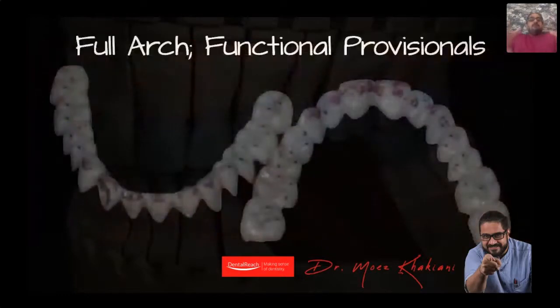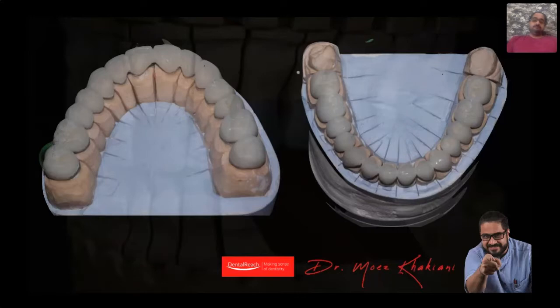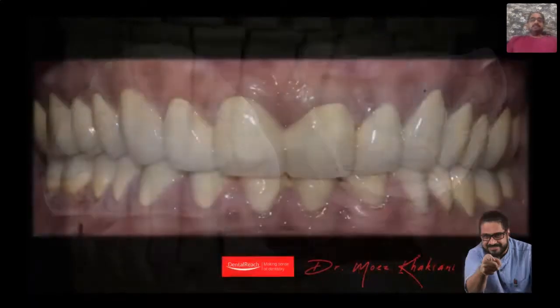So these are my full arch functional provisionals. Look at them. Dots at the back in blue, lines in the front in red, which means on provisionals, I have achieved mutually protected occlusion. My hard work is done, because now when I make alginate impressions of these and send them to the laboratory, the technician can make putty indices or use CAD-CAM technology and copy the exact same anatomy into the final restorations. When they all come back to me, this is how it goes in.